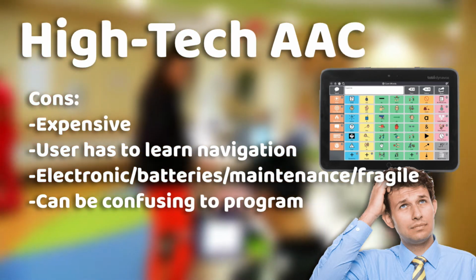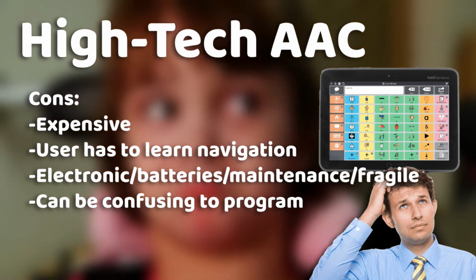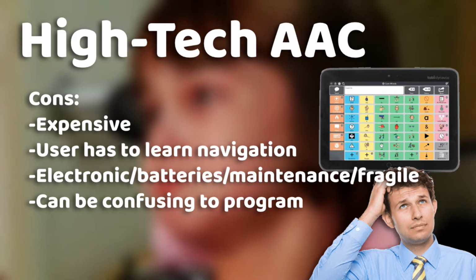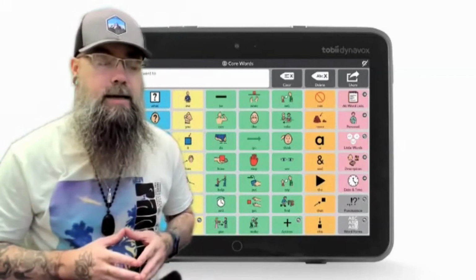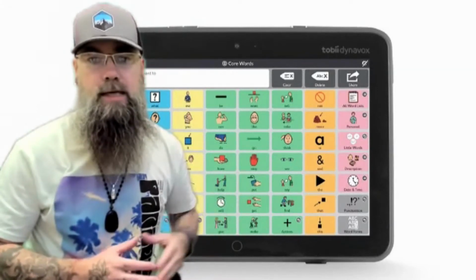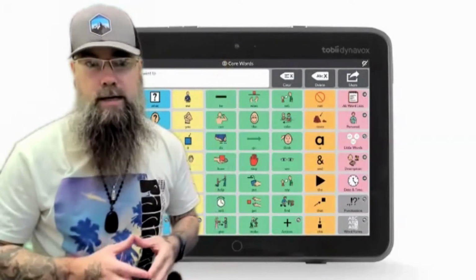Although many of the programs do come pre-made, the navigation and customizing usually takes a lot of steps. There are plenty of tutorials and YouTube videos on how to do it though, so there are resources out there to help. This is a good and common example of a high-tech AAC device, the Tobii Dynavox. What you see here is a whole dedicated device with a touchscreen, camera, and eye retina tracker.